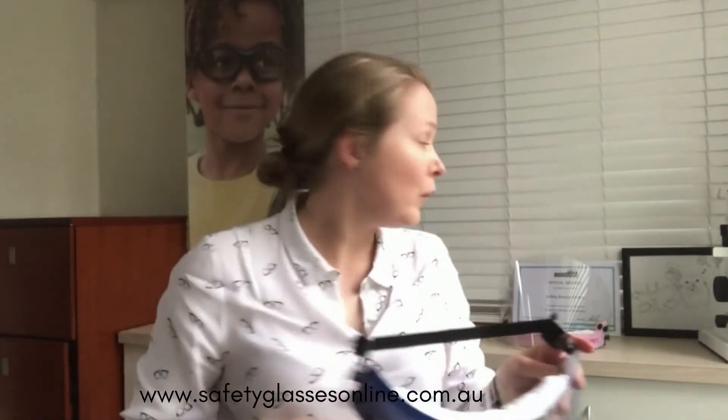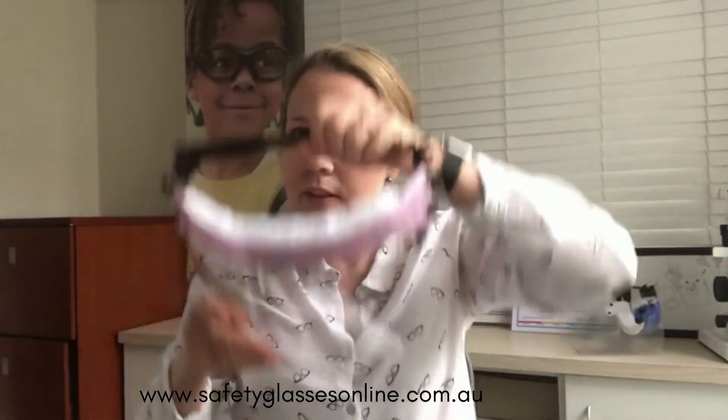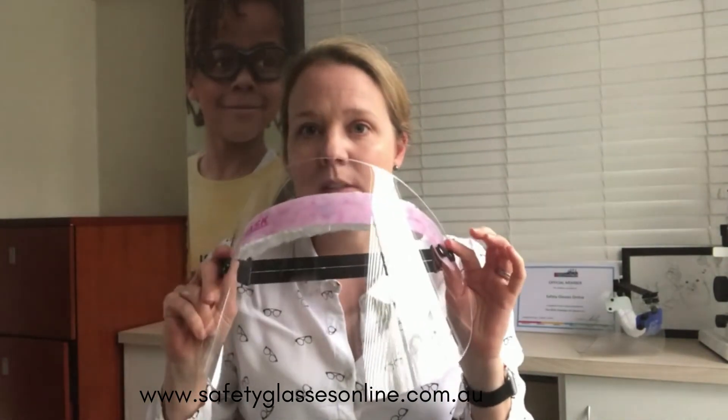Now this is the mid face shield — the one that goes to chin. The full face shield, which is the full medical face shield, is actually much longer. This one is medium impact certified and also TGA approved against splashes and spills, so that's really handy.